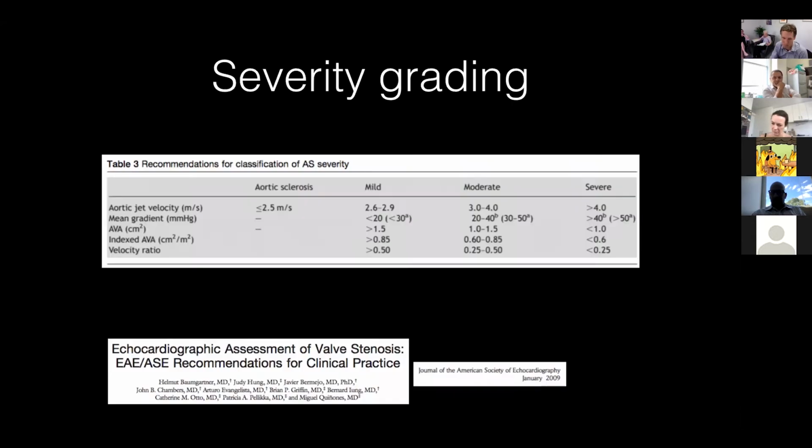Sometimes, if the valve looks fine and it opens well, sure, we can flick through that, but not when you've got a valve that looks like that. So lots and lots of different angles.